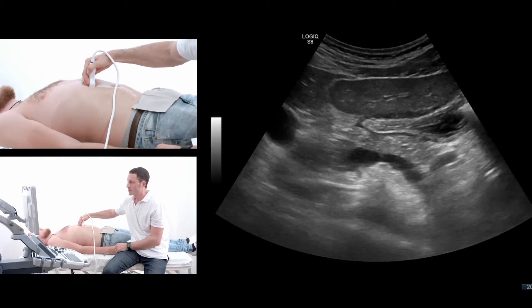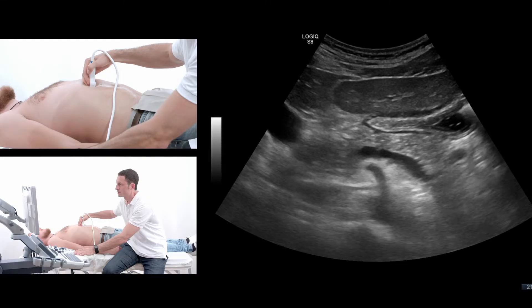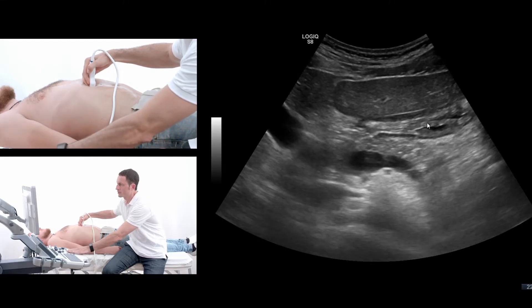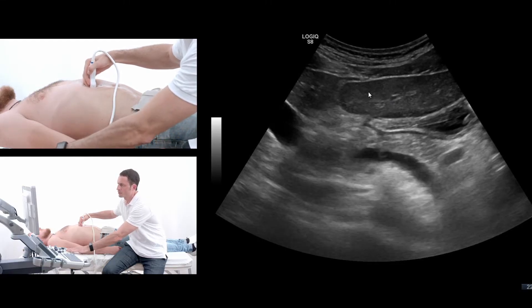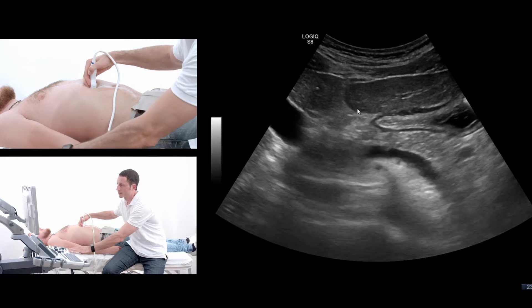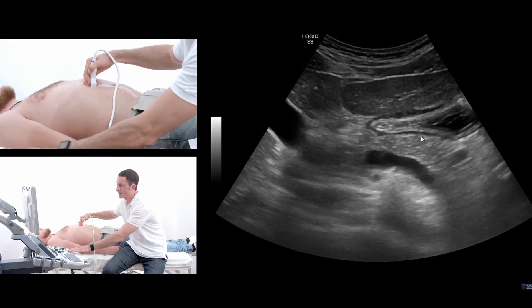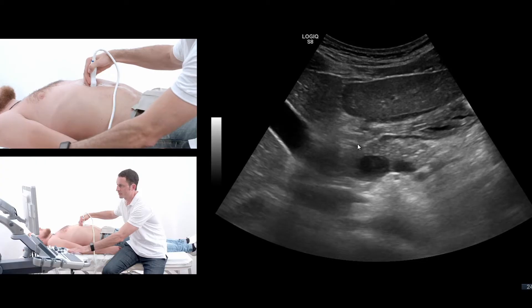What we see here is the stomach, the left liver lobe, the right liver lobe, the interlobar fissure. And then you can see this structure right behind the stomach, which is the pancreas body.